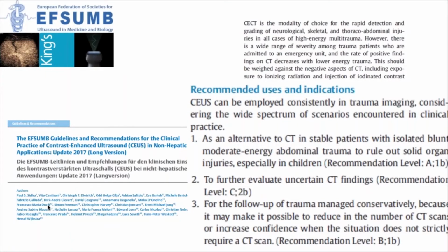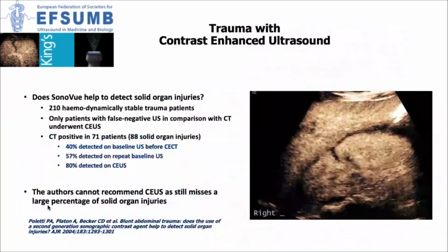abnormalities or incidental findings. Perhaps what we use it for the most at King's is in the follow-up of major trauma and single organ injuries, particularly splenic, hepatic, and renal lacerations, where you want to see retraction of a scar, or you want to see that there is an improvement and no development of a pseudo aneurysm particularly.